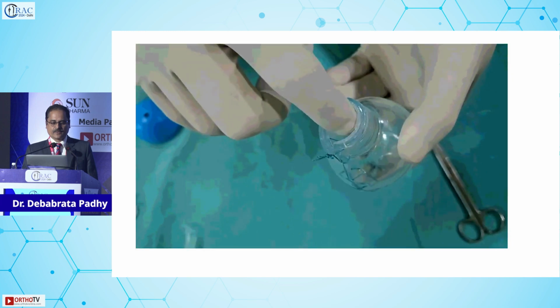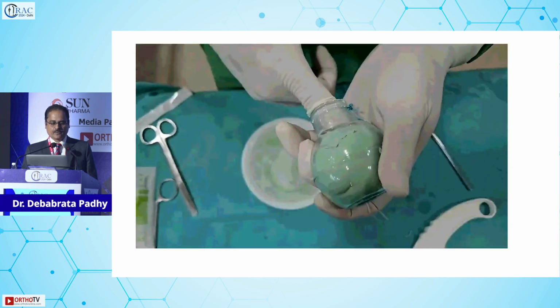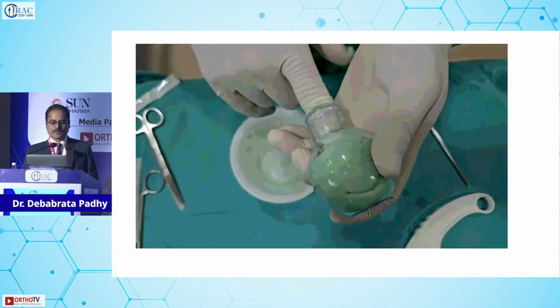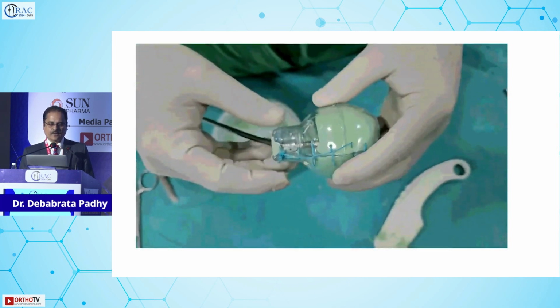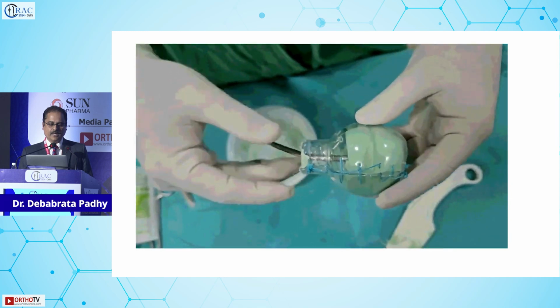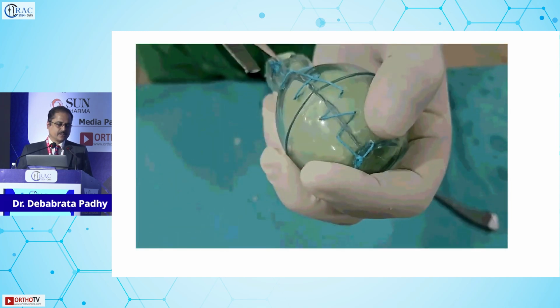So this is how it is totally sealed, and the cement will be pushed inside it in the doughy state. Before that you have to add the antibiotics and press it inside so that the whole thing is filled and the Steinman pin is in situ in that.